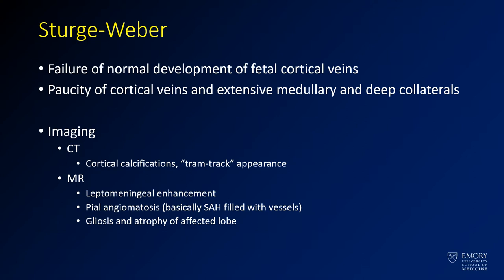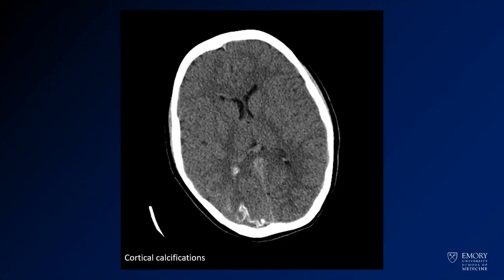You can get gliosis and atrophy of the affected lobe. Here you see the cortical calcifications that we were referring to — this kind of tram-track type of cortical calcification.